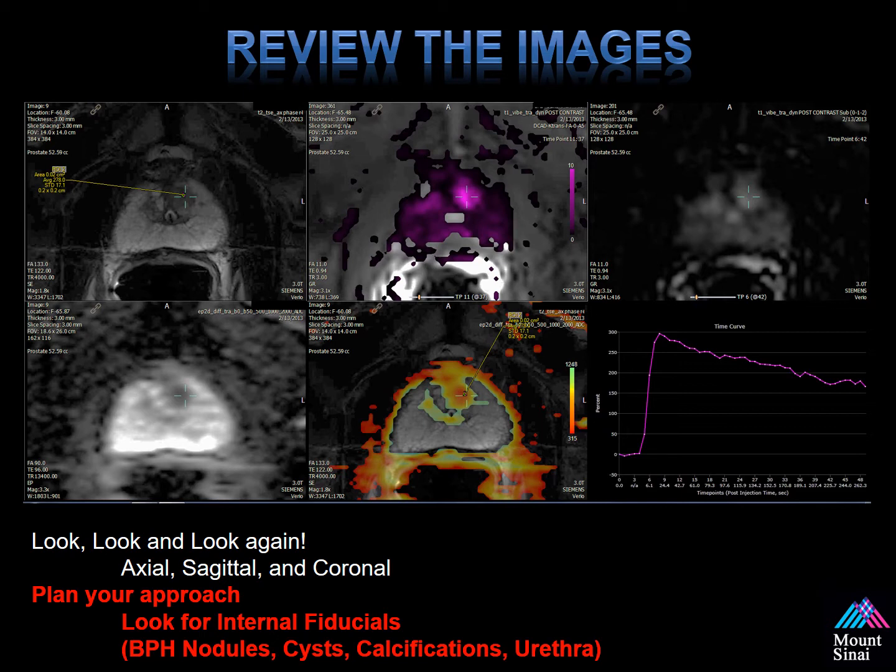Looking at the top row in the upper left-hand corner, you see an axial T2 image of the prostate with a left anterior lesion marked. Moving across, you see a dynamic contrast enhanced MRI color-coded in the middle box, and to the far right are the raw images showing early arterial enhancement. Moving to the bottom row, in the lower left-hand corner you see a apparent diffusion coefficient map — that dark area with the crosshairs is identifying an area of restriction. The middle shows a color-coded ADC map laid on top of T2 images. The lower right corner shows the dynamic contrast enhanced MRI contrast enhancement curve, which shows early uptake and early washout — indicative of prostate cancer. Reviewing your images will impact your results and make you more successful when performing fusion biopsies.